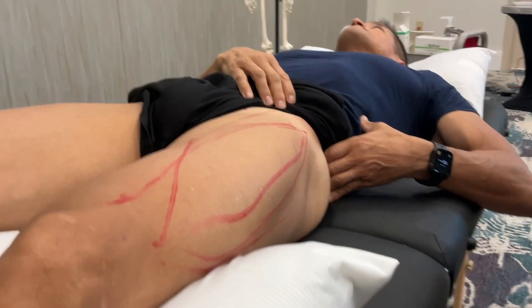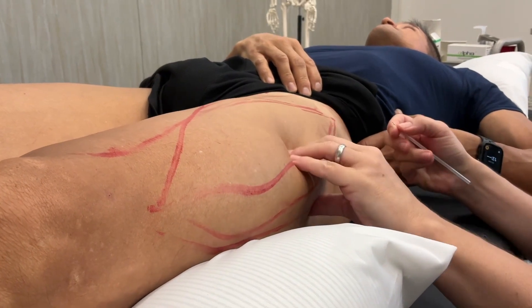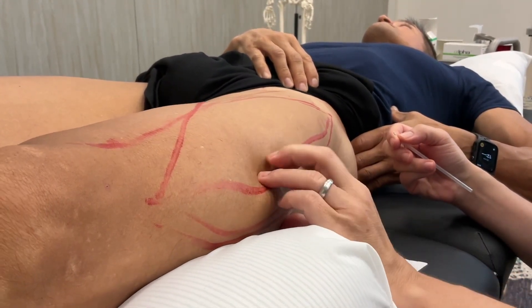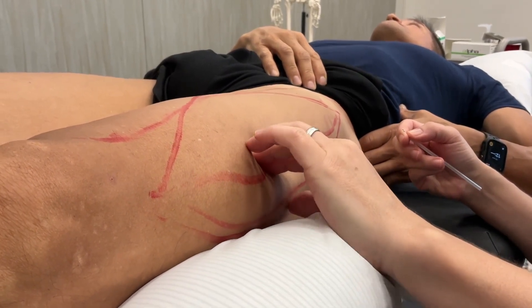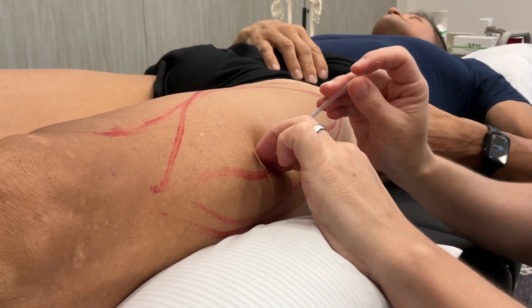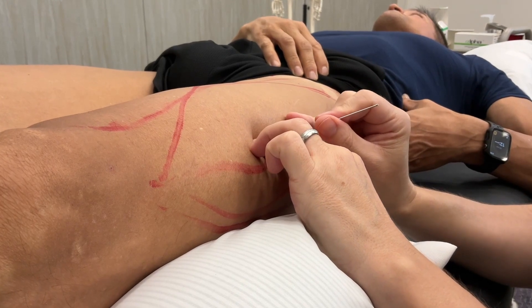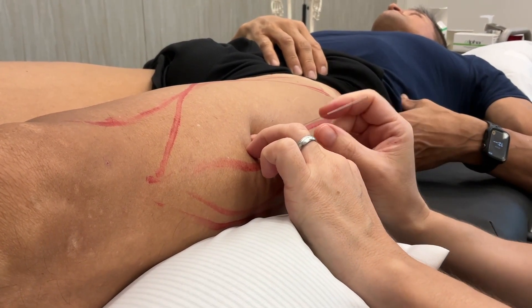So I'm gonna move down this. I really like to get to know the muscle. It's already softened substantially. He has a big one right here, just right here. So I've got a nice, very superficial jump on that one.